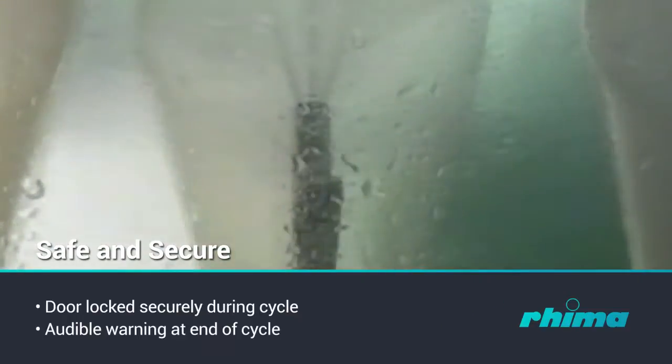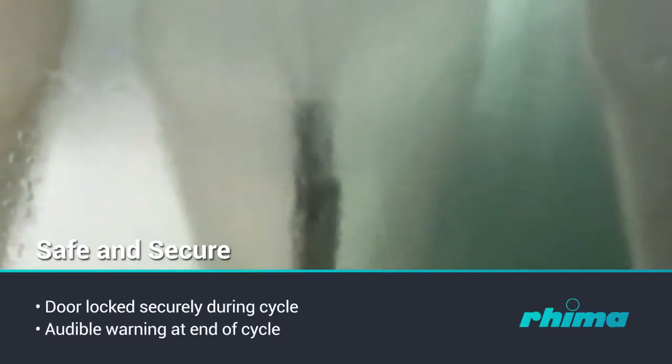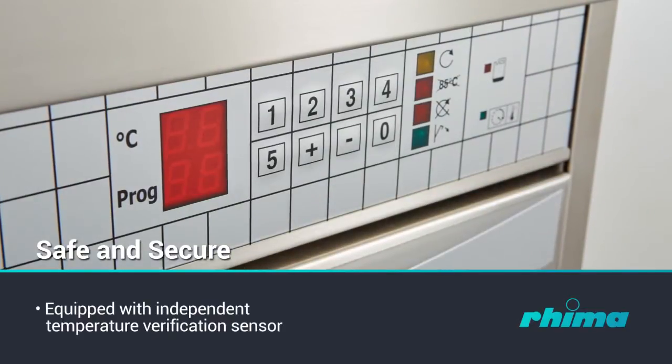In order to guarantee that the values of the critical process variables were truly obtained and as programmed, the Deco 190 is equipped with a verification level A independent temperature verification sensor.